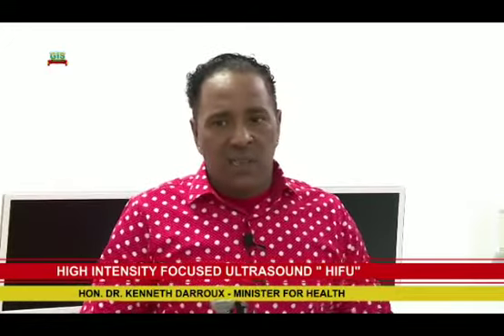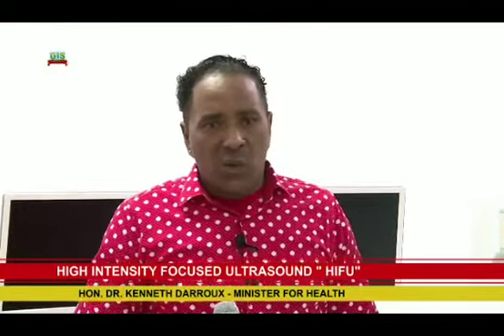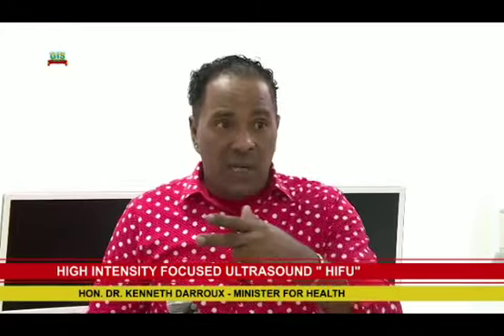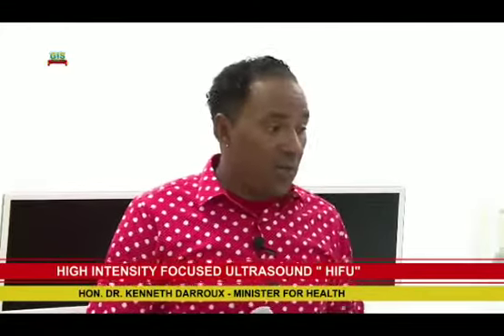In other words, if the cancer has already spread to your lymph nodes and other parts of your body, this machine will not be useful, okay? So it's an effective tool, especially in early diagnosis. And I think my friend was mentioning also breast cancers and breast tumors, both malignant and benign tumors.